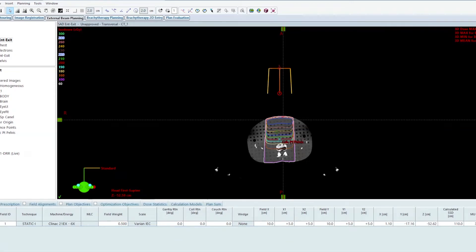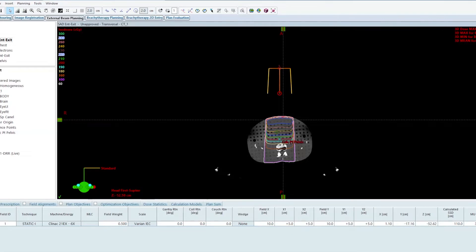This example is going to be an extended distance SAD treatment. I'm only going to do one field here because typically these treatments are done for extremities, either like a whole femur treatment or a whole leg treatment with matching fields.